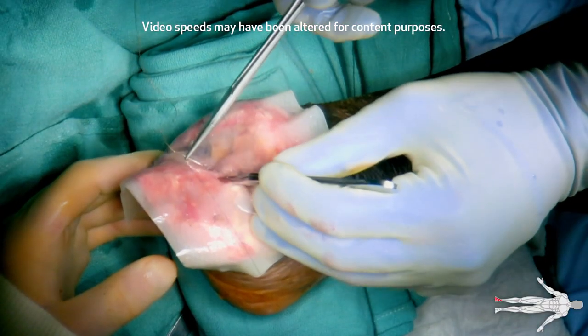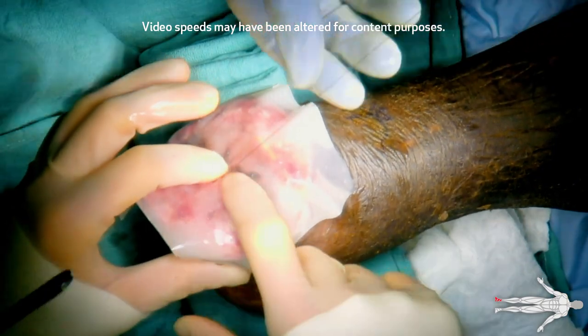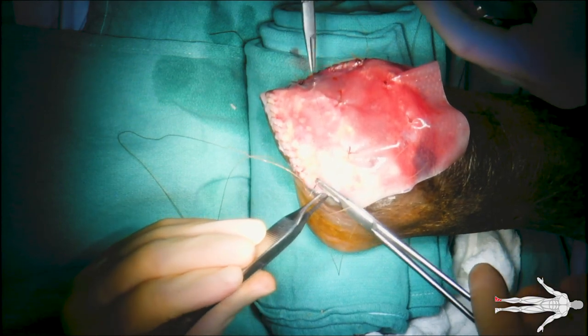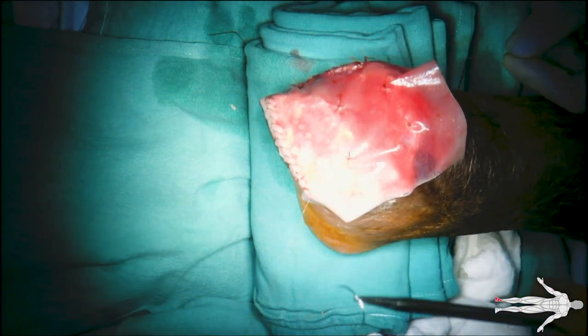Quilting sutures are demonstrated here to help adhere the Integra to the wound bed and prevent seroma formation. Pie crusting, which consists of making small slits through the Integra, can be used to allow fluid egress. However, it is not necessary given the mesh nature of this Integra and was not used in this procedure.